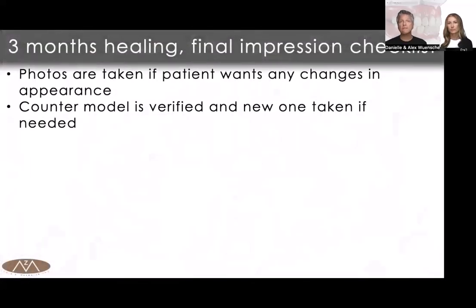Now after 3 months of healing, we're going to take the final impression, or actually not we, because we're just technicians. You take the final impression. Important is photos are taken. Always take pictures. I always tell all my clients, we all have to be good photographers, a dentist and a technician. We really have to like taking photos of our patients, because that's the most important communicating medium besides good records, good models or scans, because that will tell me what's going on in this patient's face.